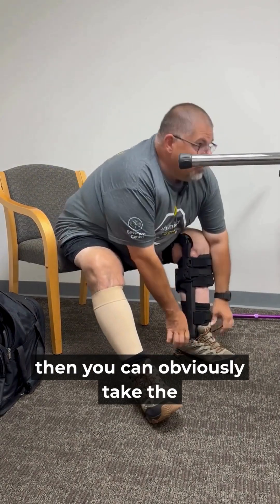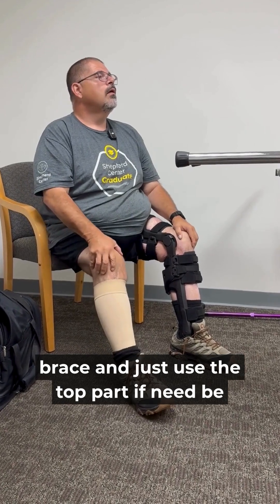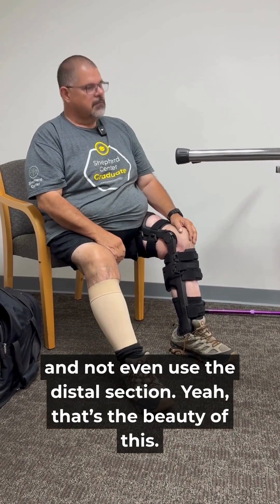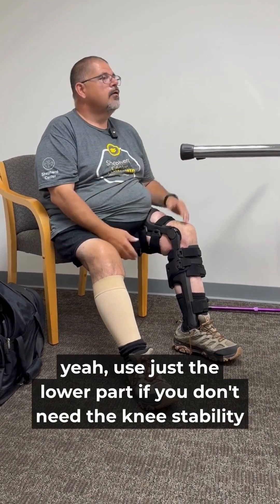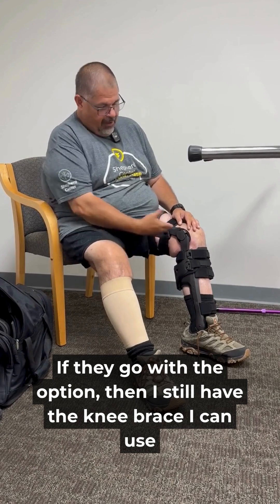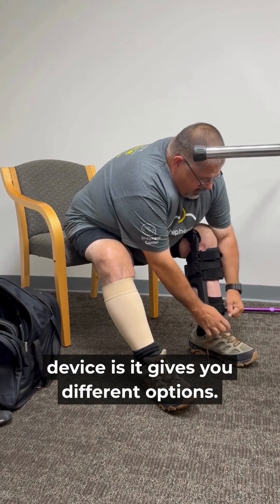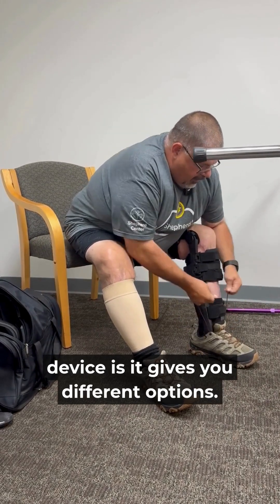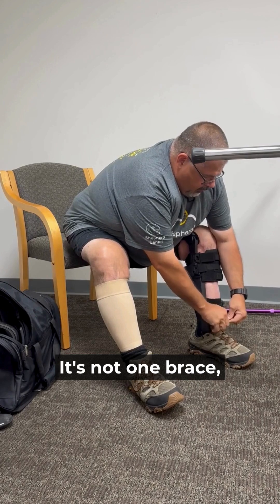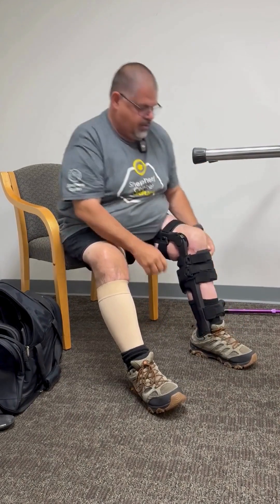If I do have the surgery, I can obviously take the brace and just use the top part if need be. If I get the knee replaced, this part comes off and I just use the lower part. It gives that option — if they go with the other option, I still have the knee brace I can use until that's fixed. That's the beauty of this device: it's not one brace, it's two that can be used separately or together.